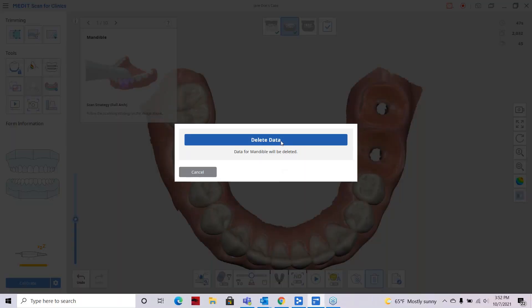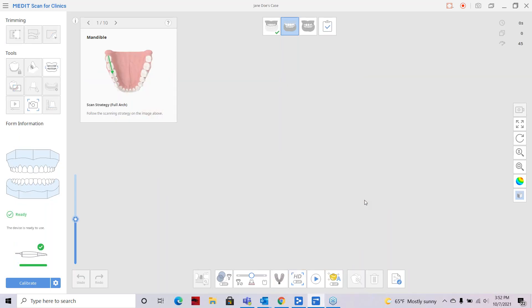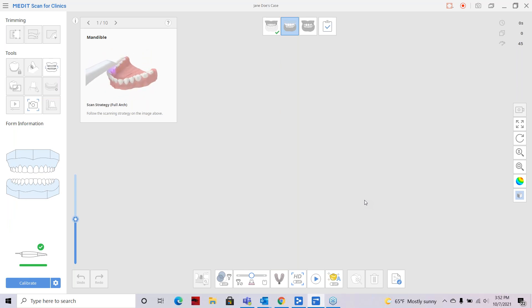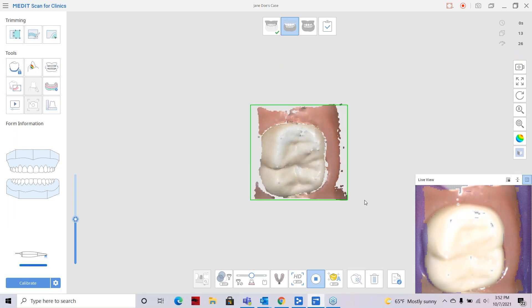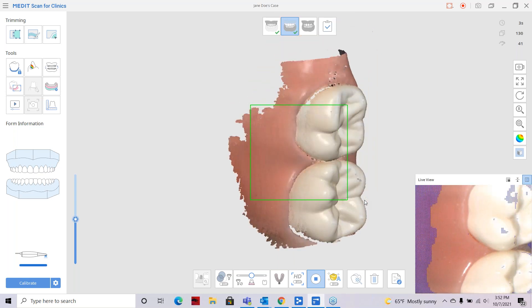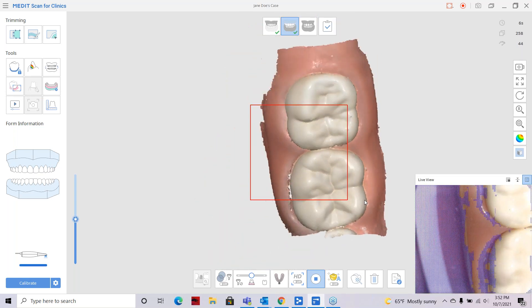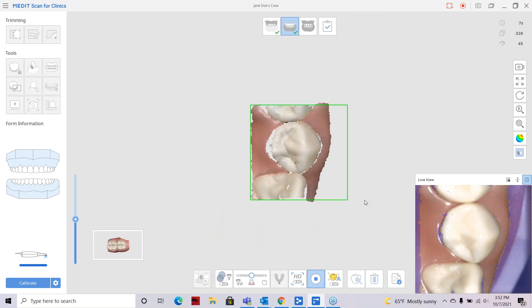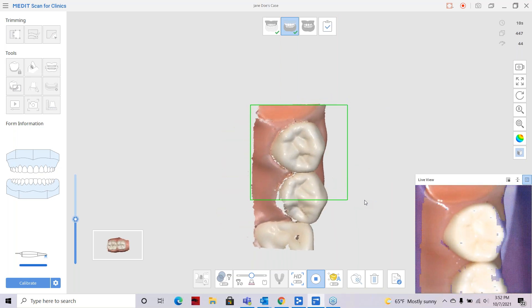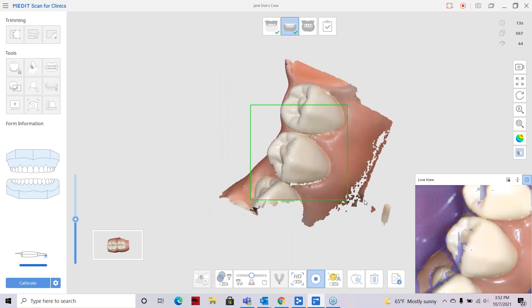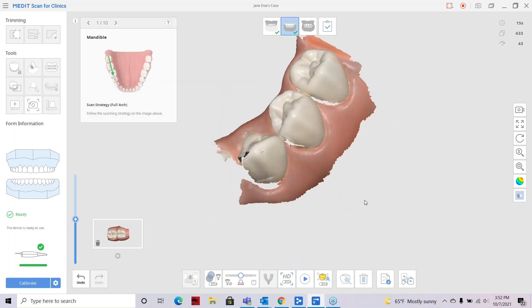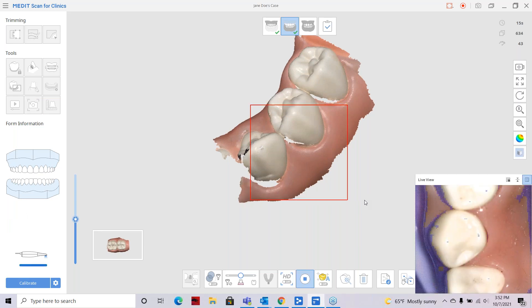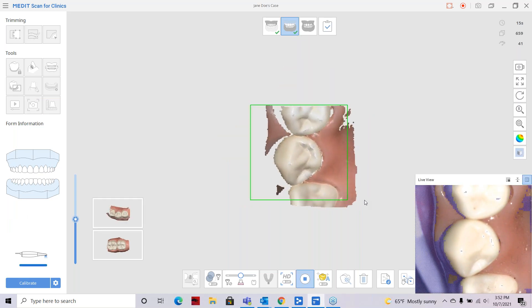Now that smart stitching is available, we can hop around a little bit more. I'll pick up my model — typically I'd scan in the mouth but scanning on the model helps for demos. I'll press start on my scanner, pick up the first tooth, start scanning through there, and then I'm going to pick the scanner up and start on another area entirely to display the features of smart stitching.